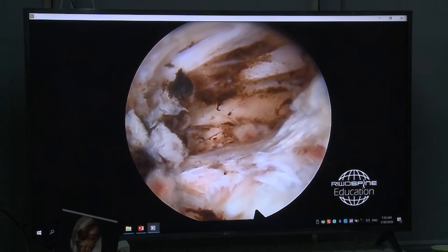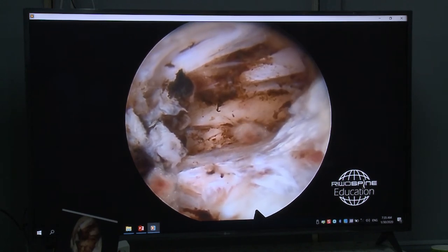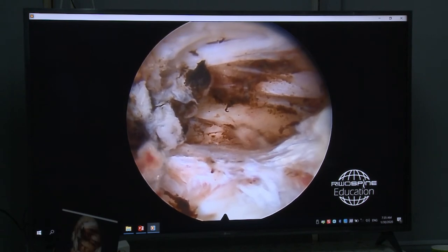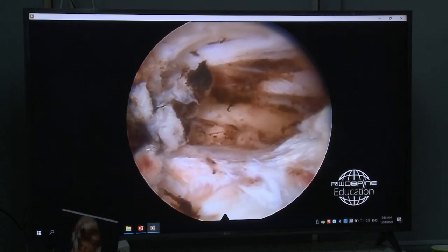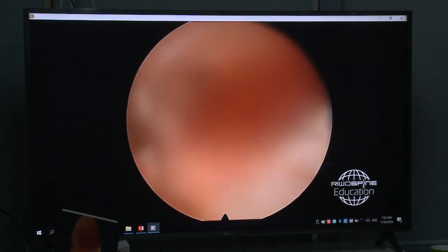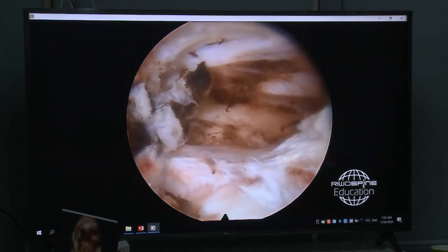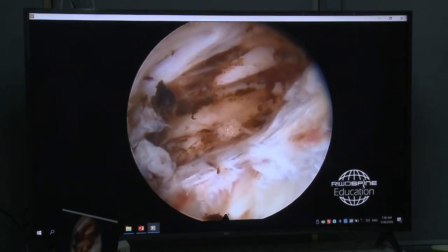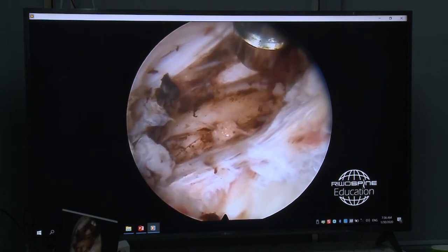Okay, again, left is cranial, right is caudal, 6 o'clock is the disc, and 12 o'clock we have the epidural space. Now we try to have a little bit of green here.